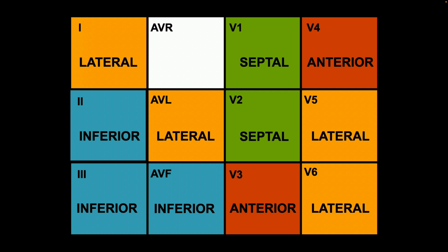Based on the questions I'm getting, I know that some people have said they've done a little bit with 12 leads. So let me ask you a nice leading question. Are STEMIs the only reason for ST elevation? Even if you have the least little bit of test-taking technique, you can answer that. No, of course not.